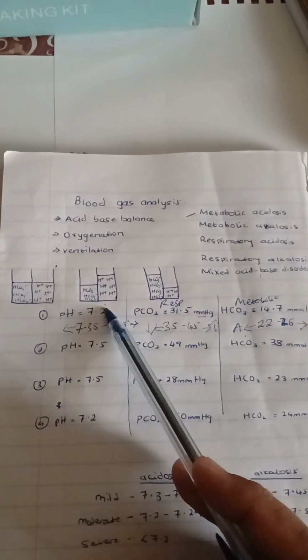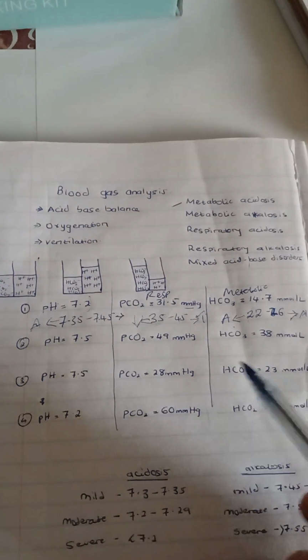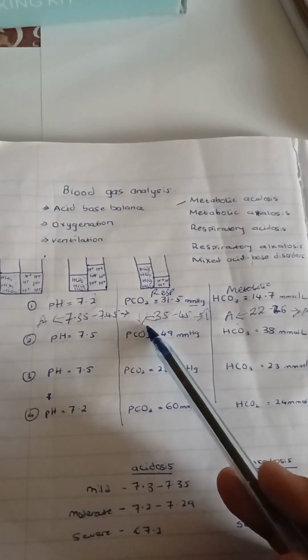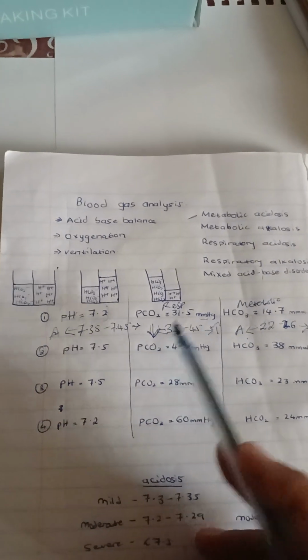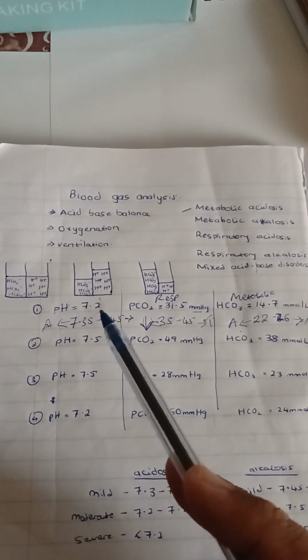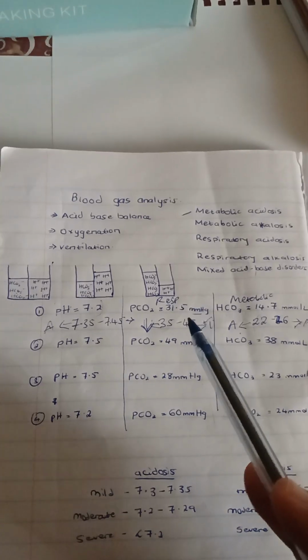pH is 7.2. It's less than 7.35. It means this patient is acidosis. Respiratory? PCO2 is 31.5. It's less than 35. So it means PCO2 is going down. If it was a respiratory acidosis, we would have expected PCO2 to go high, to be the one that is causing the low pH, but it is in the opposite direction. It is going low, it is reducing.